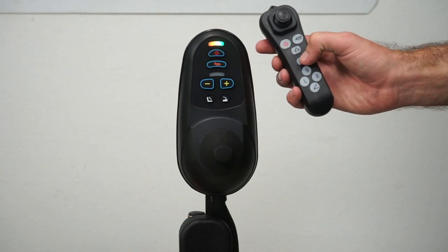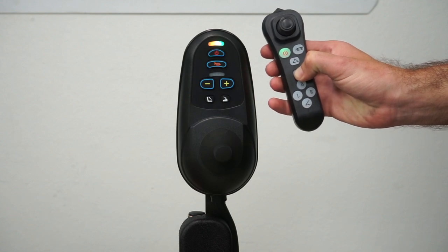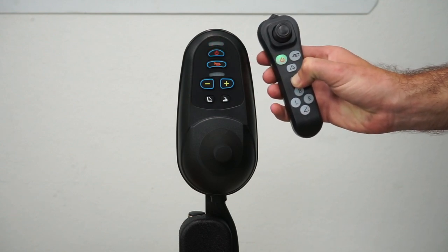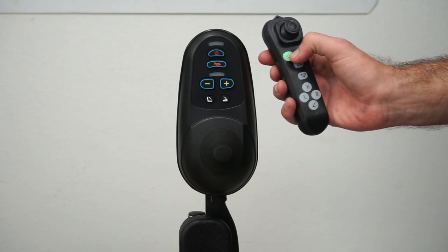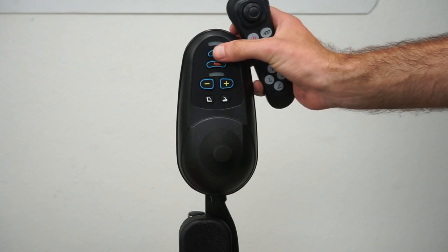Now hold the speed decrease button down on the remote control and the chair should shut off. There we go — the chair shut off. Then turn off the remote control. Now when you turn them both back on, they should be paired.